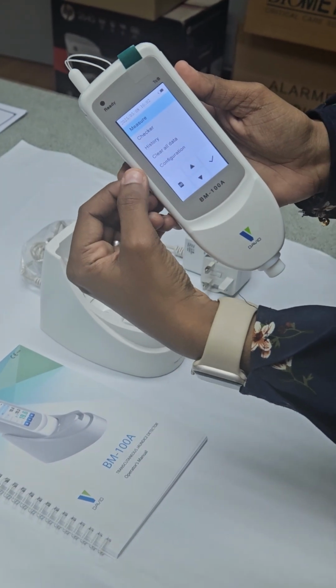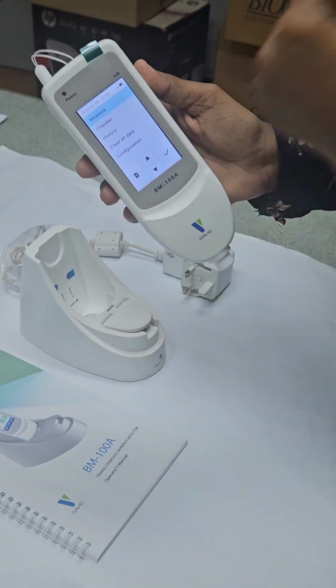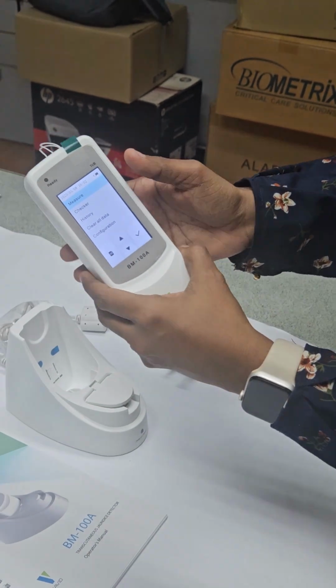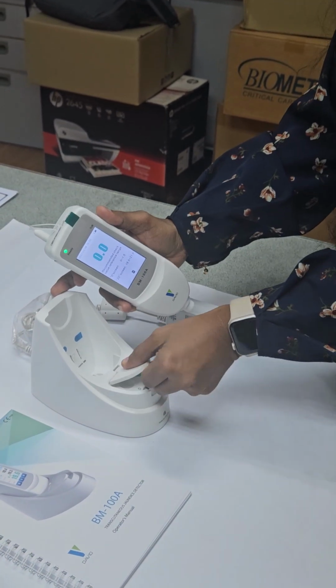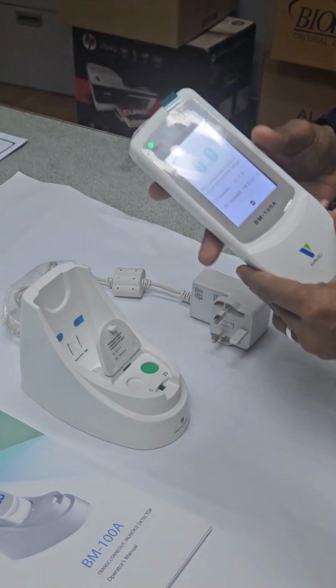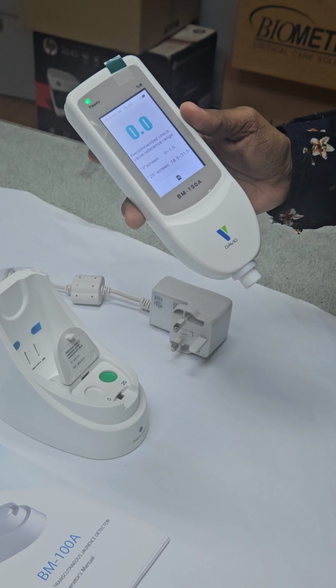Measure, checker, history, clear all data, configuration. The measure is for checking the patient directly. The checker is like a calibration checker. Here is the checker screen. Inspection checker. Normally we suggest the user do this before their usage, once a day.